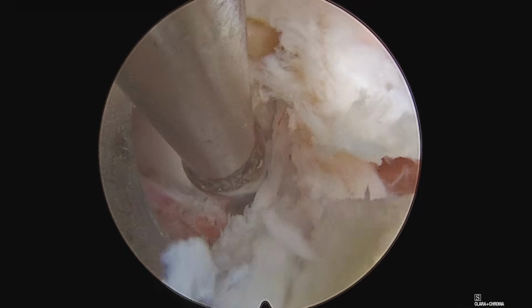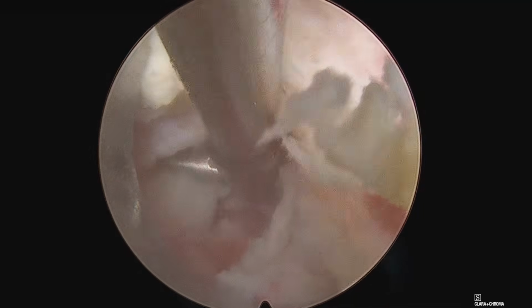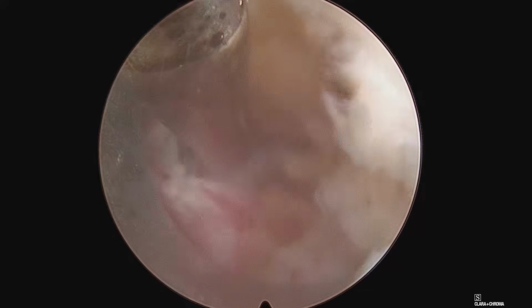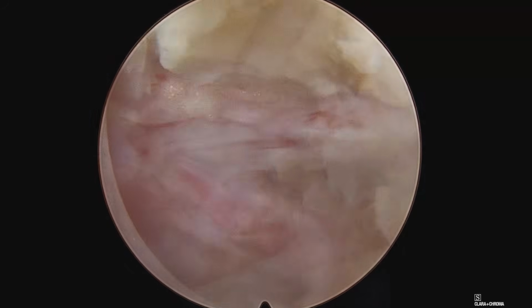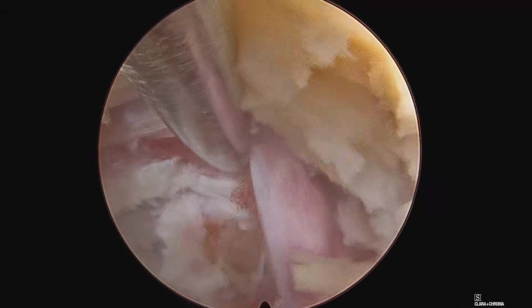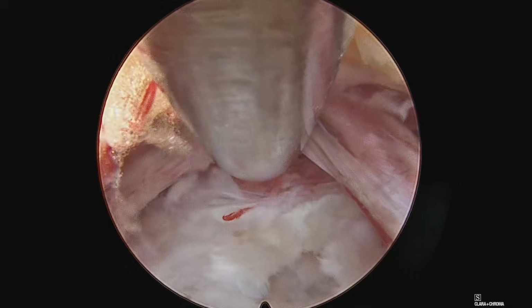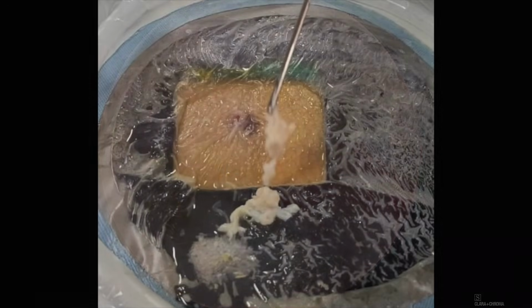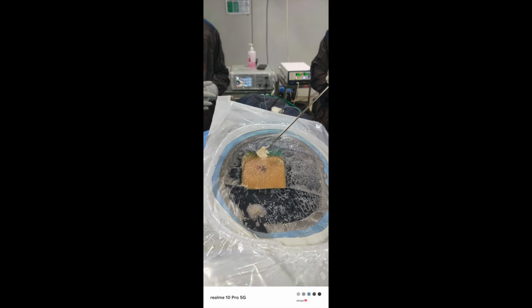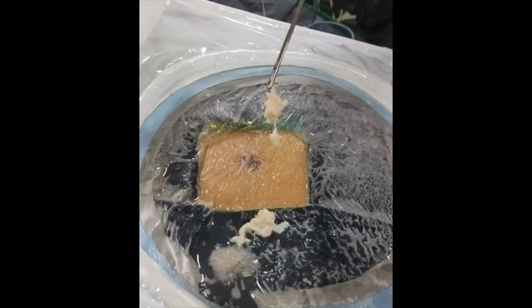Thereafter, we went in and we found some more fragments which were caudally migrated, and they were gently removed. Final confirmation was undertaken so that no free fragments or sequestrated fragments were left behind. This is just to confirm these are certain large fragments which I'm showing after the surgery.